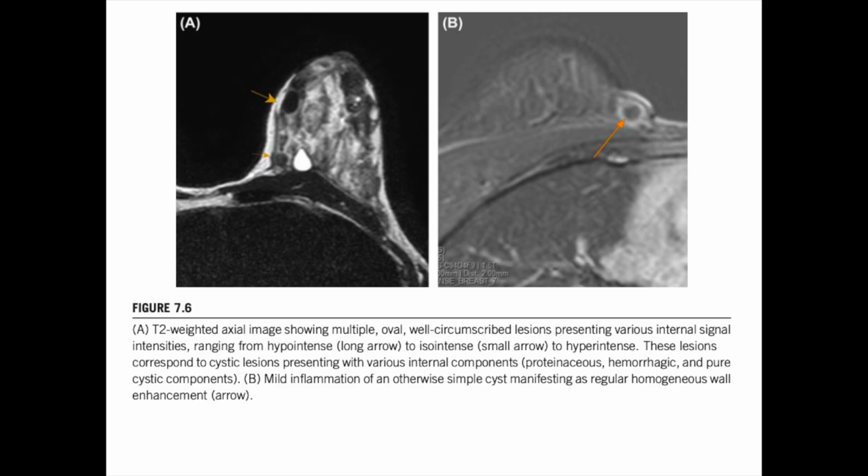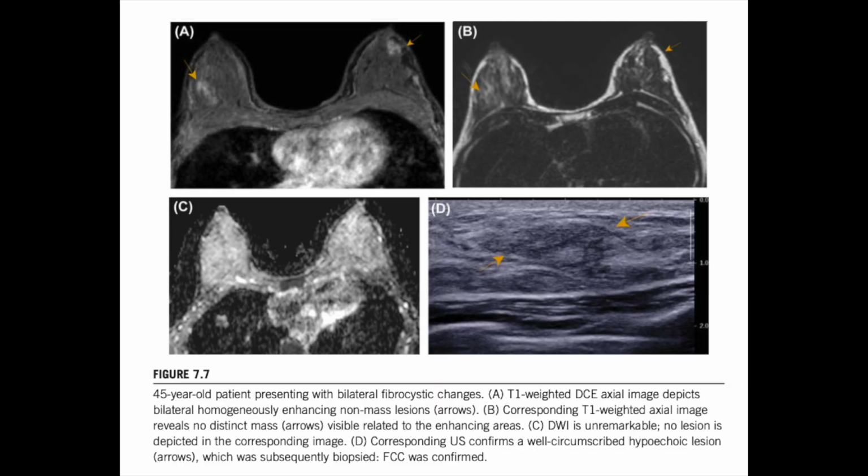Which brings us to a third layer, diffusion-weighted imaging, or DWI, and its metric, the apparent diffusion coefficient, or ADC. Yes. So what is DWI actually measuring? It's a phenomenal tool. It's basically measuring the mobility of water molecules inside the tissue. In short, it tells us how crowded the cellular environment is.